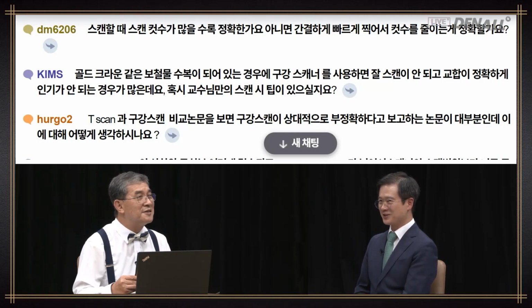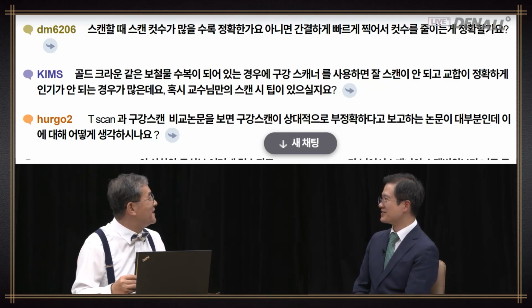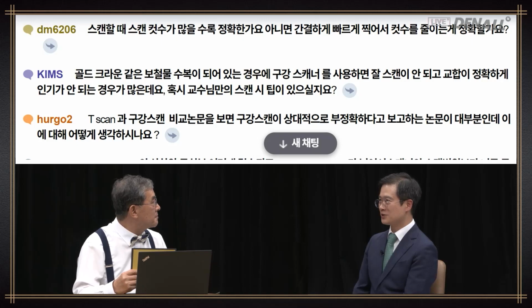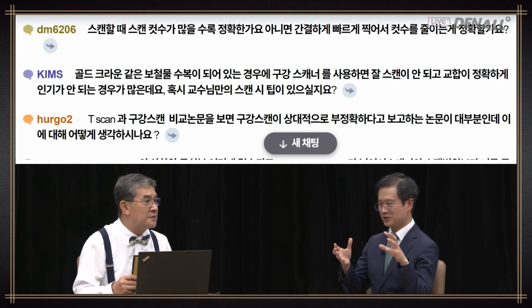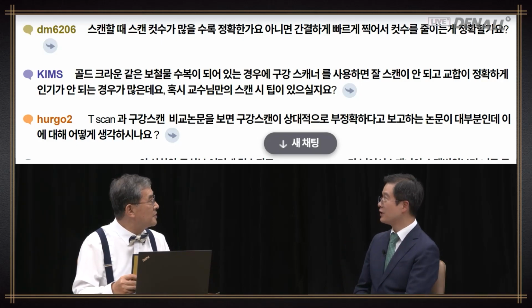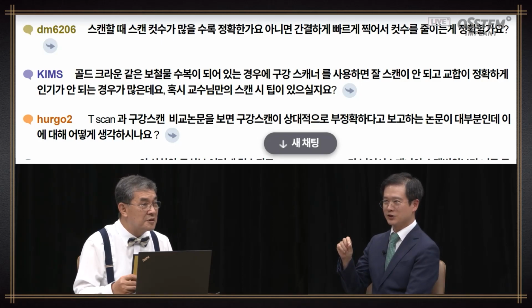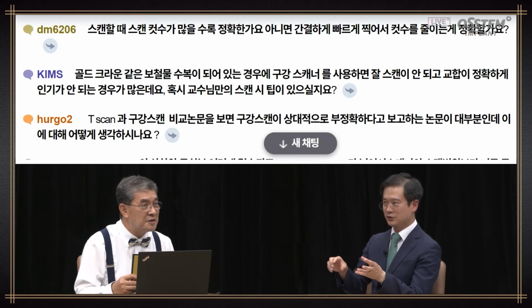I think the person already knows the answer. If the number of cuts increases, it takes time to recompose it, and the computer may put together wrong things. Therefore, values may be distorted. Doing it precisely and swiftly is important. If you turn the switch on and off, it takes a lot of time. My tip for you is to do it swiftly and to switch the scanner position drastically to get a more effective position.